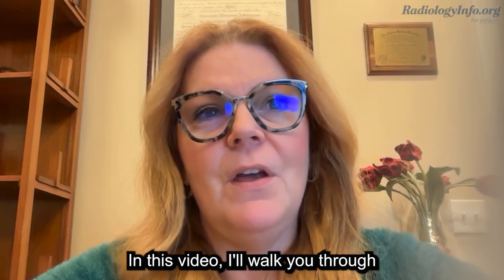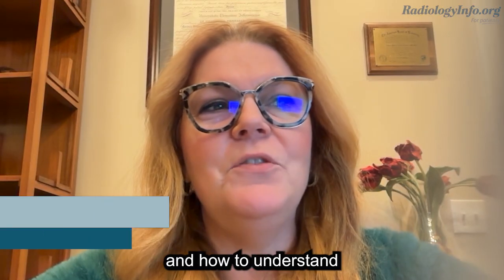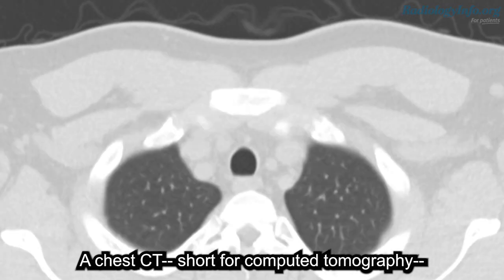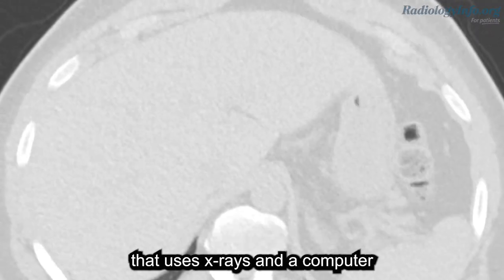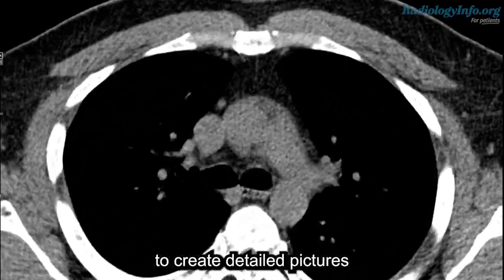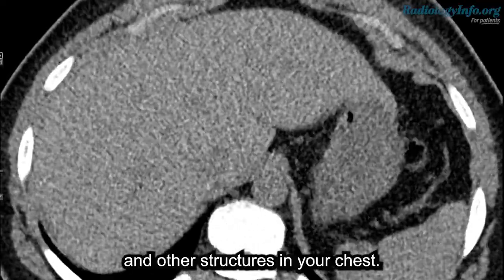In this video, I'll walk you through what a chest CT is and how to understand the main parts of your report. A chest CT, short for computed tomography, is a fast, painless, non-invasive imaging test that uses X-rays and a computer to create detailed pictures of your lungs, heart, blood vessels, and other structures in your chest.